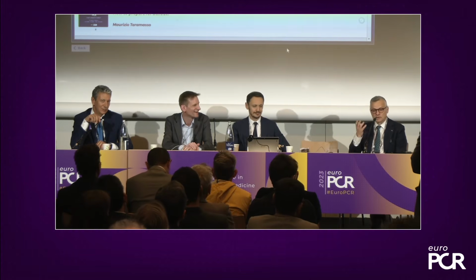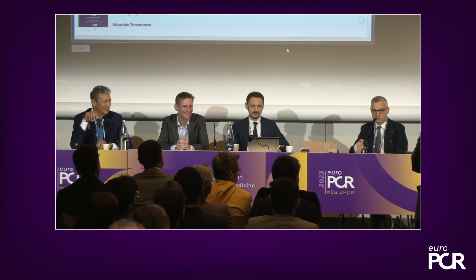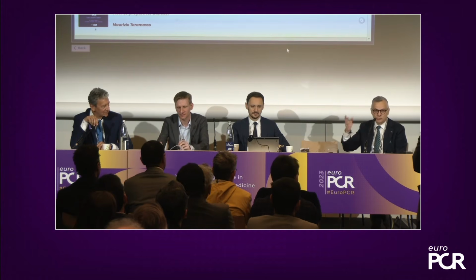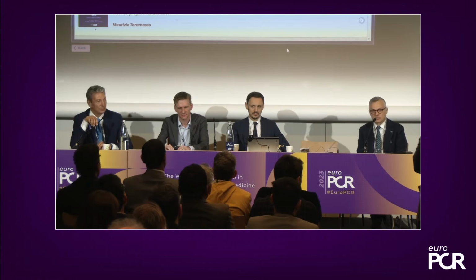Of course. So the question is very simple. Yes, you can do it, but there will be 1 out of 10 patients that will call you in the middle of the night that the patient is hypotensive and you have to do a CT scan. So I personally don't like that. I like to close the case.